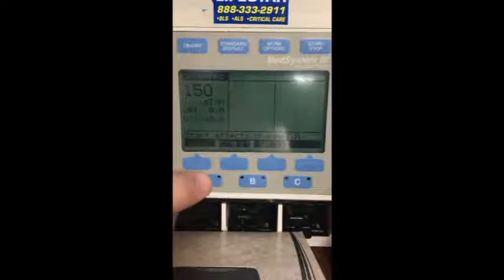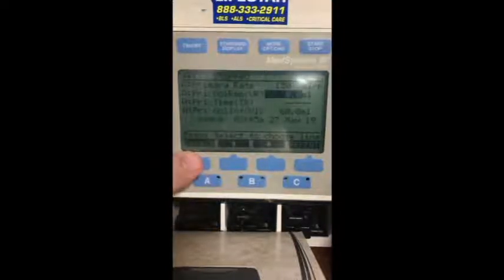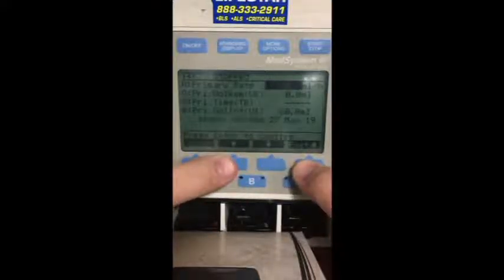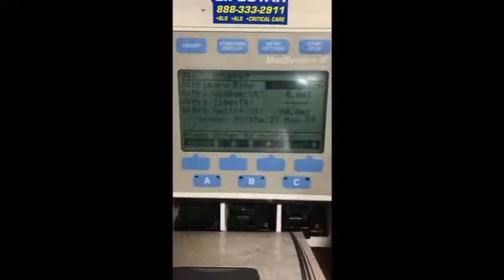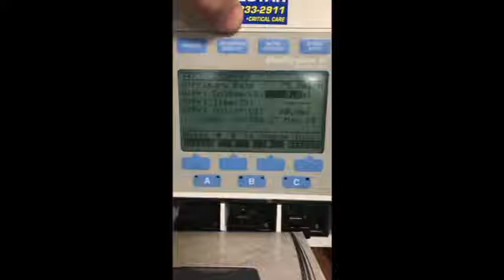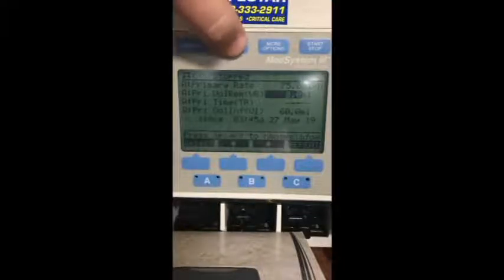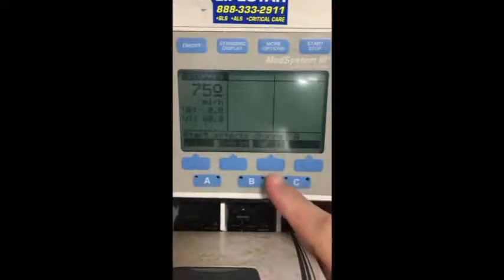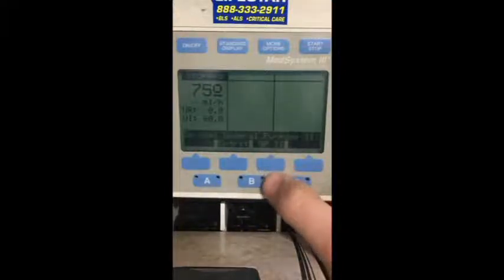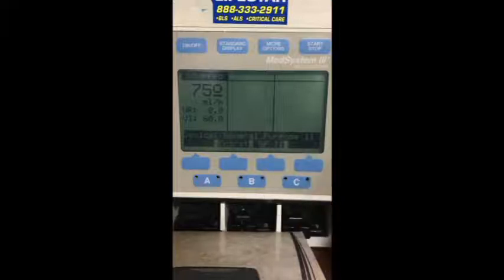If we select the channel, you can see that under 100 that we are able to deliver 0.0. So general purpose, you can always hit the standard display screen, get to the home. You can always see that it should be general purpose 2. If we click on it, you can see that.